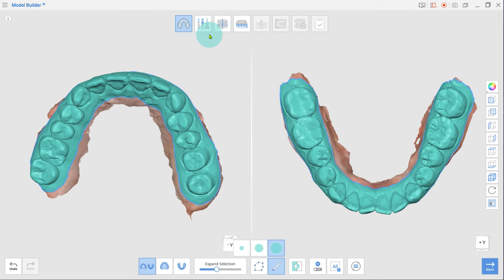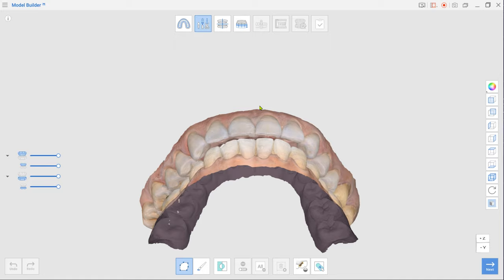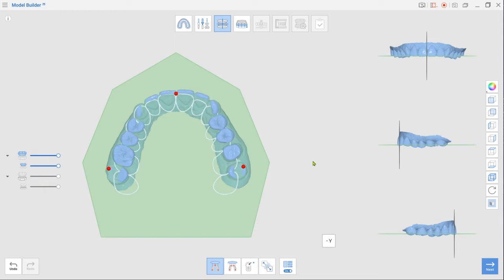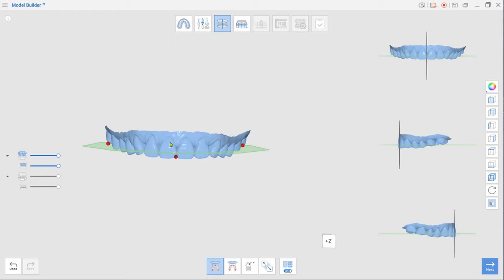Click Next to enter Edit Mode, where you can trim the scan data or fill in holes. Once done, move to Alignment Mode. Select three points on the data as shown in the video to align it with the virtual occlusal plane. Ensure the data is properly positioned by reviewing it from all angles in multi-view.